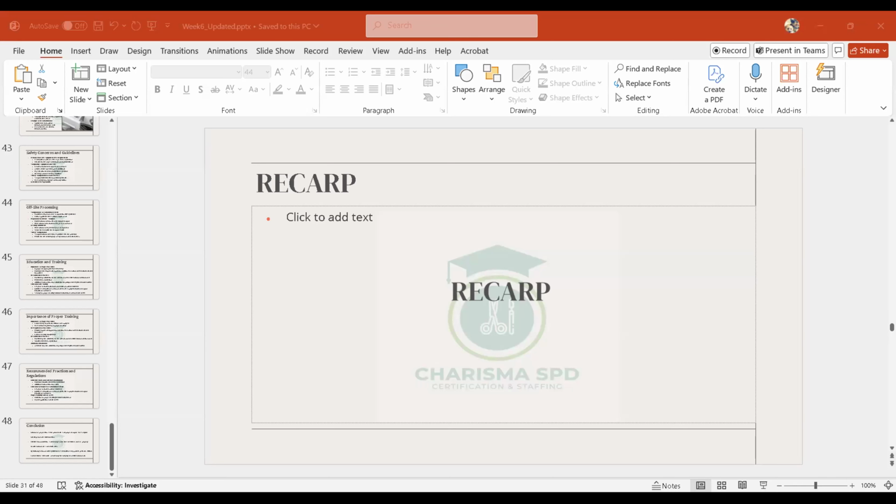Somebody typed it should have a metallic bottom. It must have a solid bottom. It was mentioned as a durable bottom. Yes, it must have a solid bottom. The solid bottom will prevent drippings, spillage, and the instruments falling apart. So if a cart does not have a solid bottom, an open cart cannot be used for transport. Does that make sense?